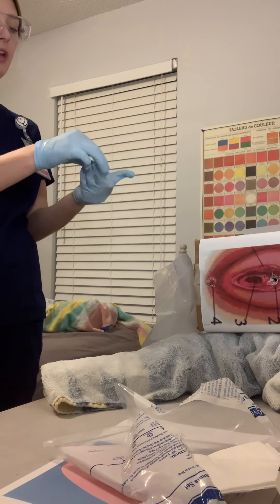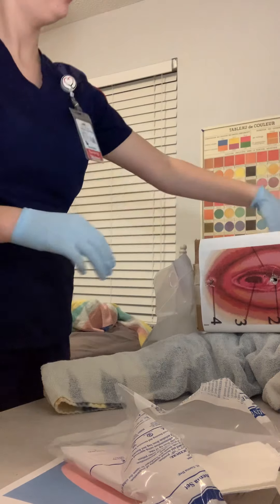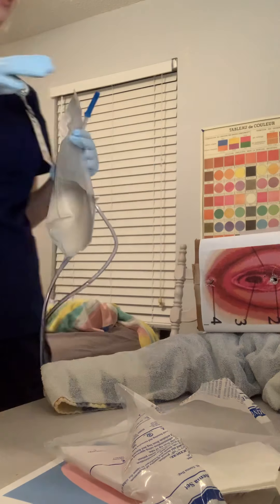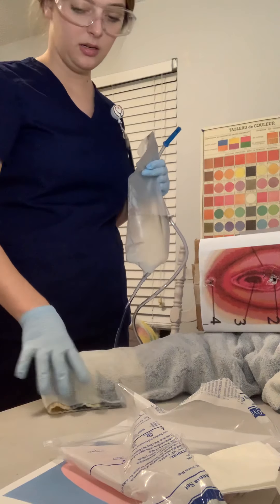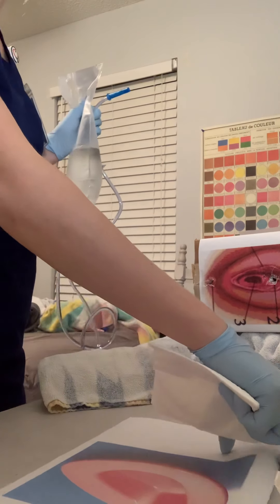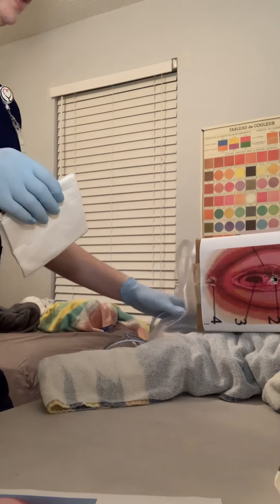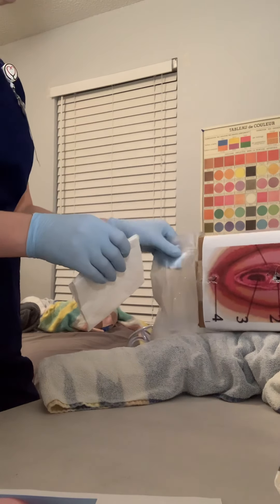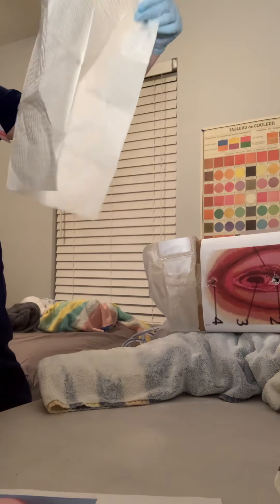I'm going to raise the bed to a working height, lower the side rails, and tell my patient about the procedure that's about to happen. I'm going to assist them into left lateral Sims position, and I'm going to put down the waterproof pad with the shiny side facing down.